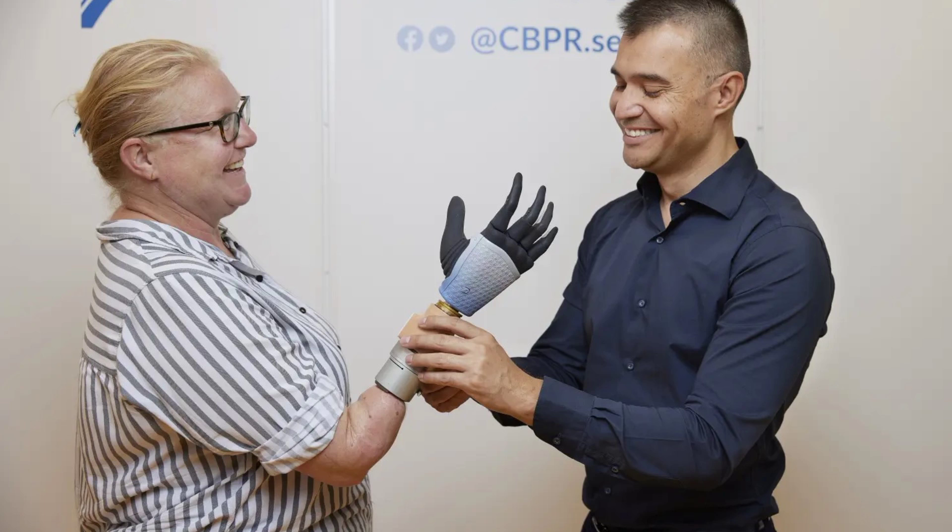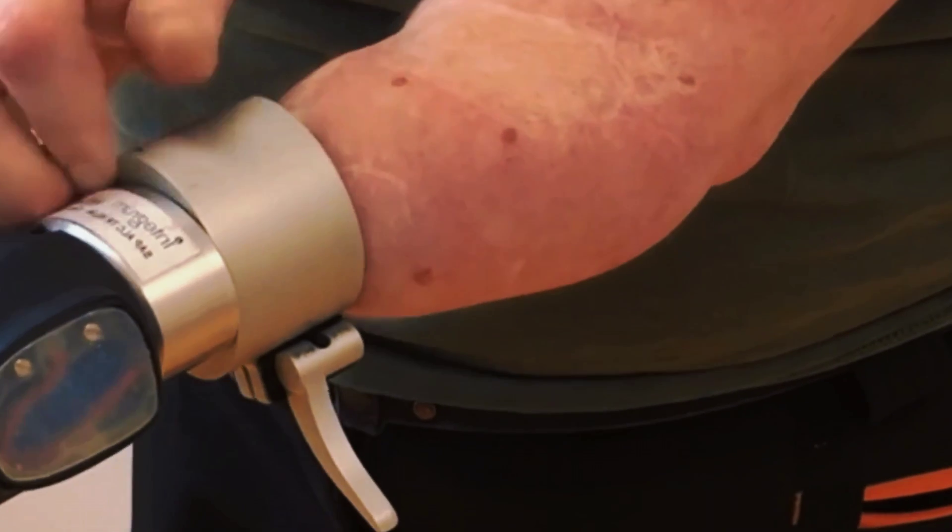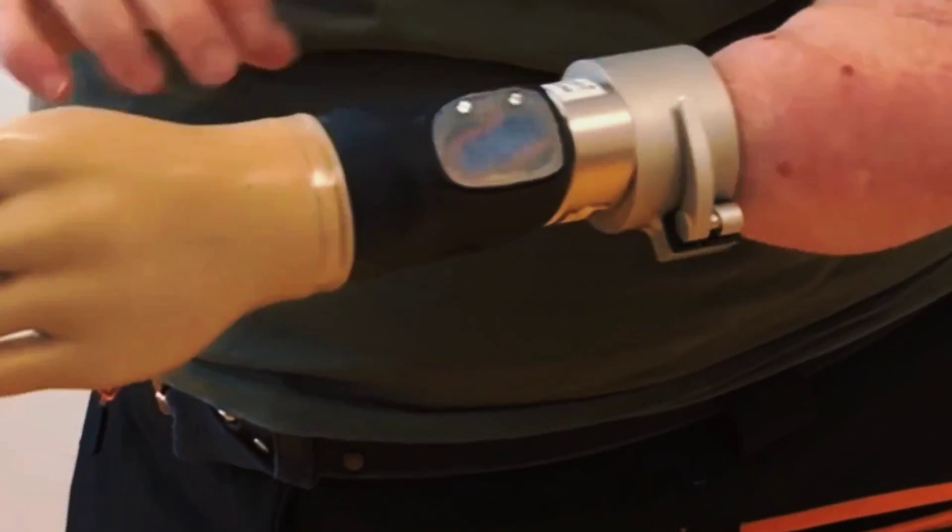The goal of the project was to develop an interface that would allow amputees to have more natural and intuitive control over their artificial limbs, as well as to feel some sensations in them.